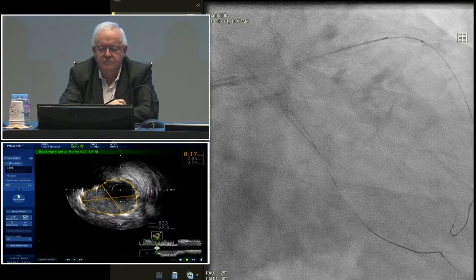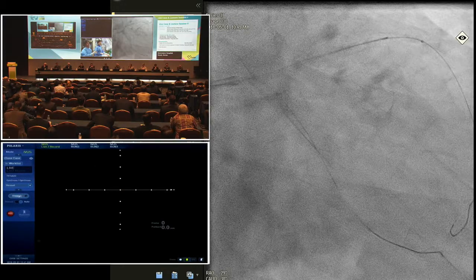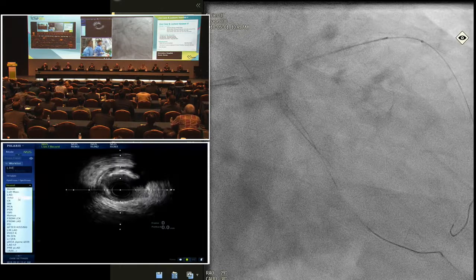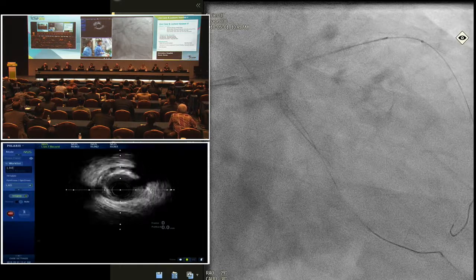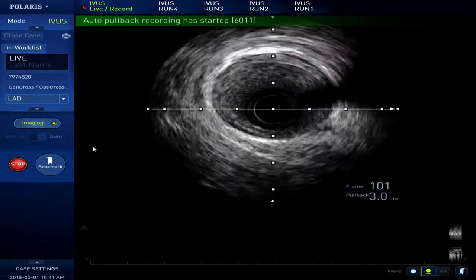Please show the IVUS. LAD first. Let me check, pull back from the LAD. This is the LAD.